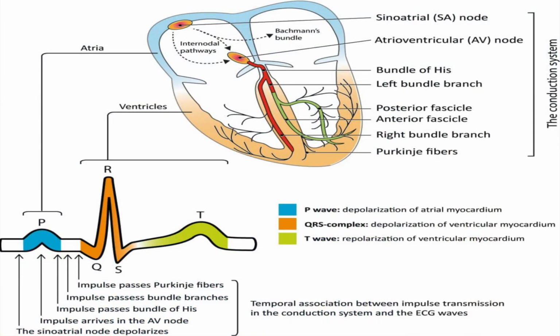Now we'll see the relationship of electrocardiographic complex lead system and electrical impulse. The heart conducts electrical activity which the ECG measures and shows. The configurations of electrical activity displayed on the ECG vary depending on the lead or view of the ECG and on the rhythm of the heart.